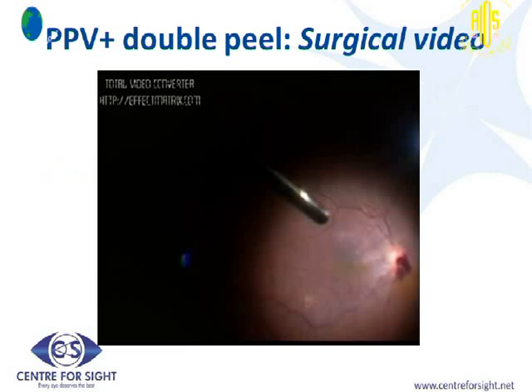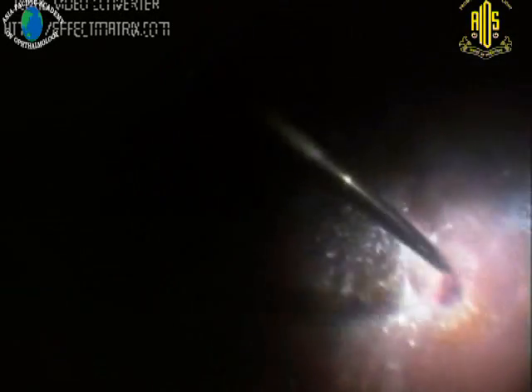We did a vitrectomy for this case. I am showing the injection of triamcinolone dye. Now, what is to be noted is the PVD induction, just like vitreopapillary traction, has to be very gentle, because otherwise you can get a massive bleed from these saccular aneurysms. So after the PVD induction, the rest is easy. We did a double staining using trypan blue dye first under air, followed by BBG dye to remove the residual ILM.